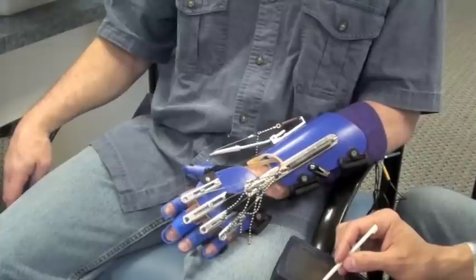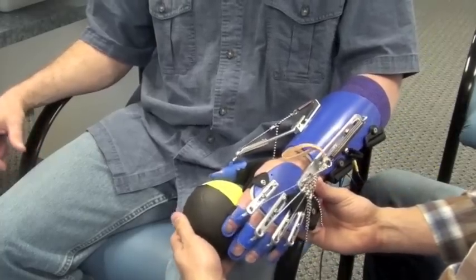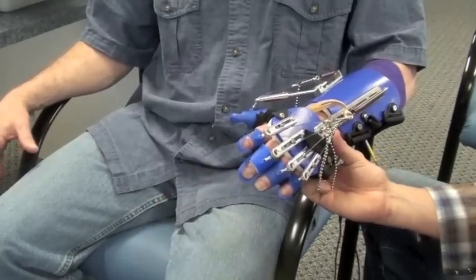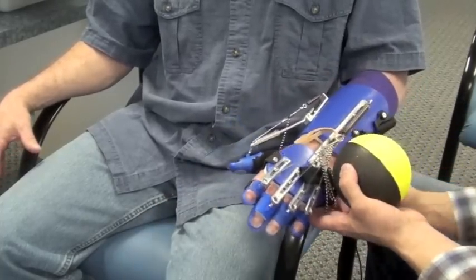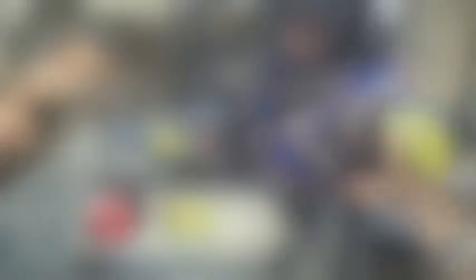After you have the electrical stimulation level set, you will also set the activation and deactivation thresholds. Then you'll test to make sure that the patient can exceed the activation threshold, and when they relax and drop the ball, they can fall below the deactivation threshold.